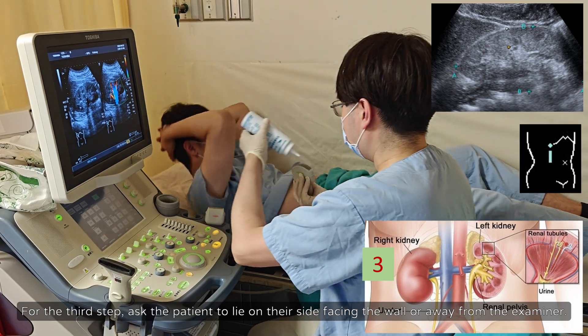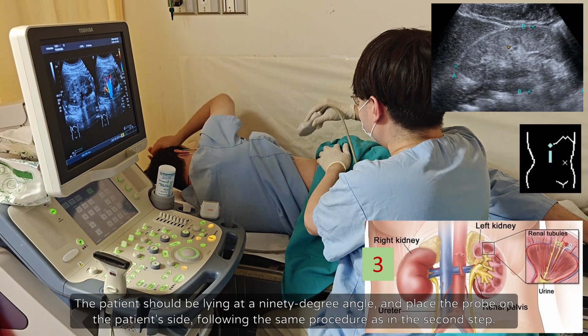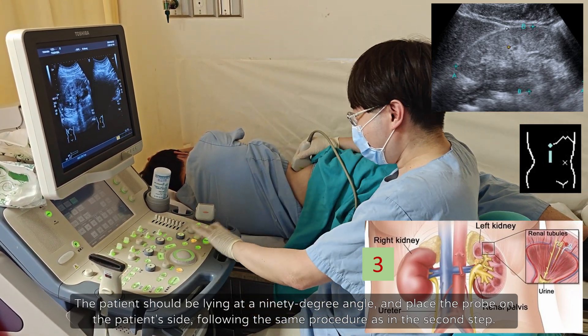For the third step, ask the patient to lie on their side facing the wall or away from the examiner. The patient should be lying at a 90-degree angle, and place the probe on the patient's side, following the same procedure as in the second step.